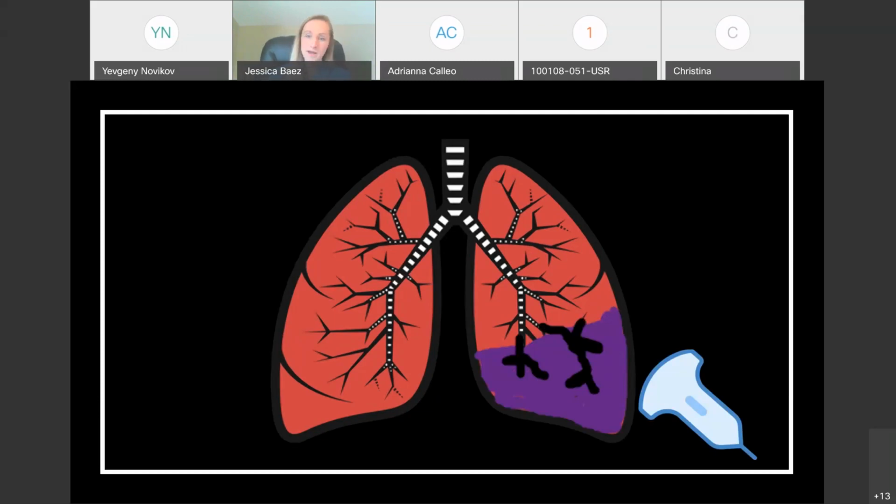And by that I mean, is it air? Is it fluid? Is it bone? You guys know? Fluid, awesome. So fluid is anechoic on ultrasound.